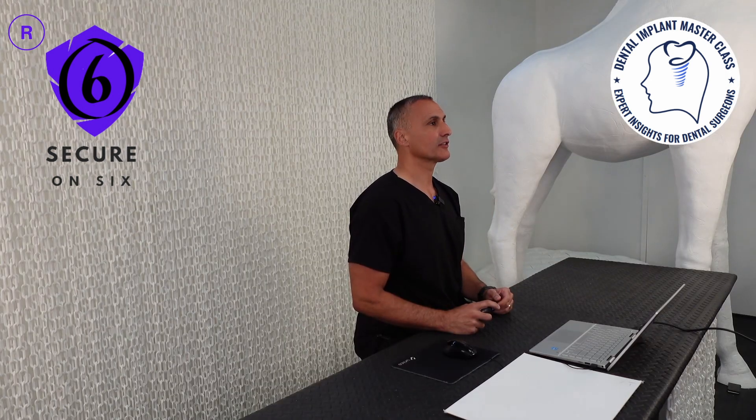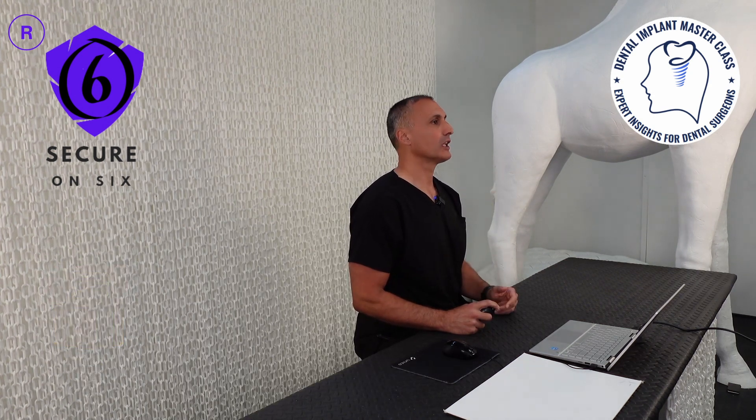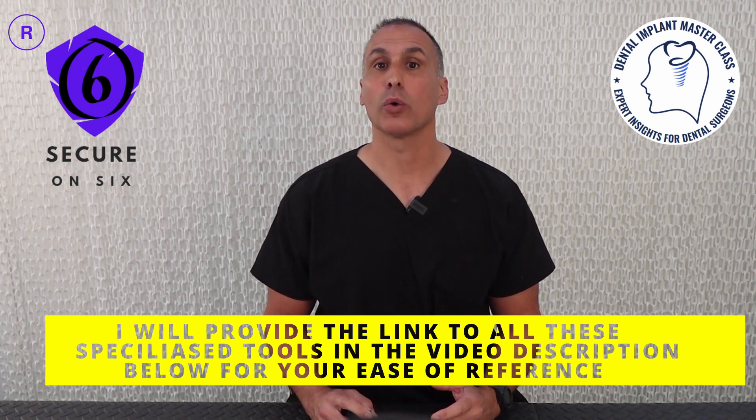I also checked the fitting surface of the implant-supported lower denture and the female equator abutments on the fitting surface of the lower denture and the lower implant-supported bar framework, and there were no evidences of pitting, voids, or discrepancies.